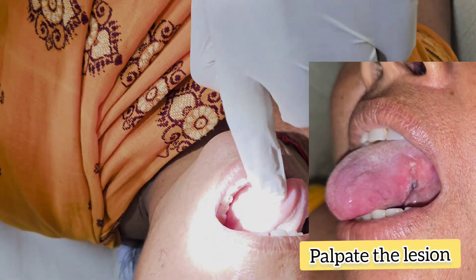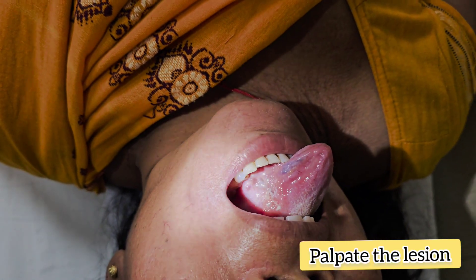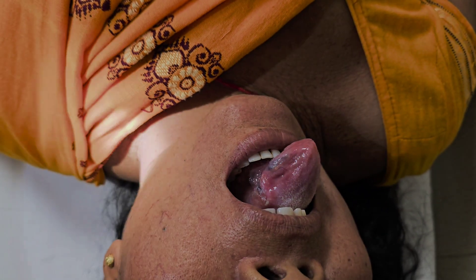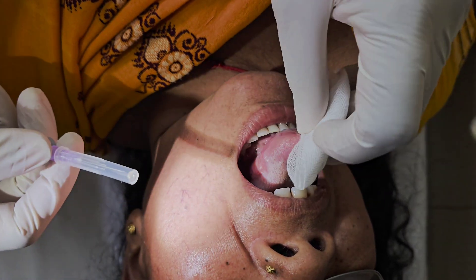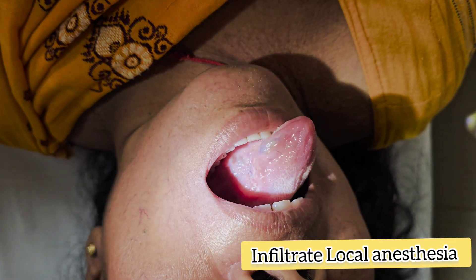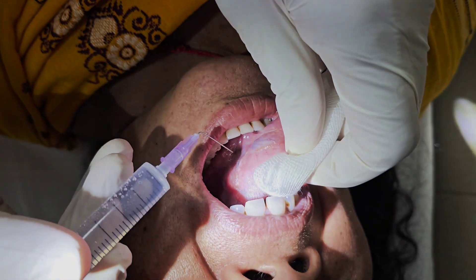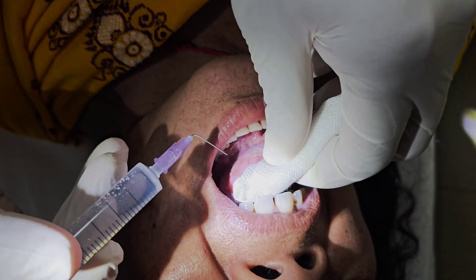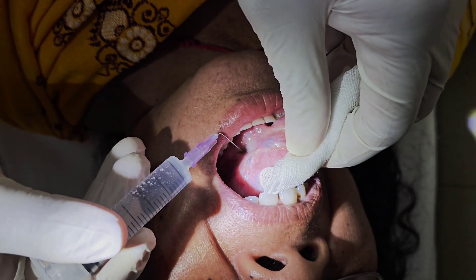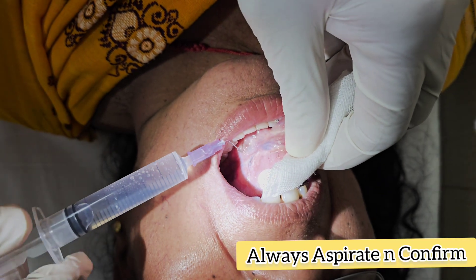This is the lesion. First we will be infiltrating local anesthesia. Always aspirate and confirm before injecting.